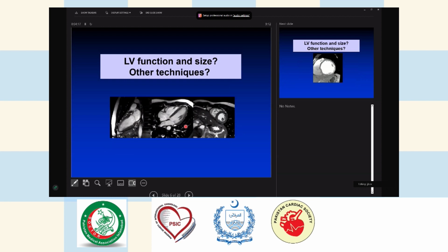I like in most of these patients with severe heart failure to have an MRI. Why? Because you see so much better exactly what's going on in this ventricle and what's going on in this atrium and what's happening with the valve. Here you see a normal patient where it's very clear: right ventricle, left atrium, you can see the pulmonary vein inflow happening here. And this is the right atrium.